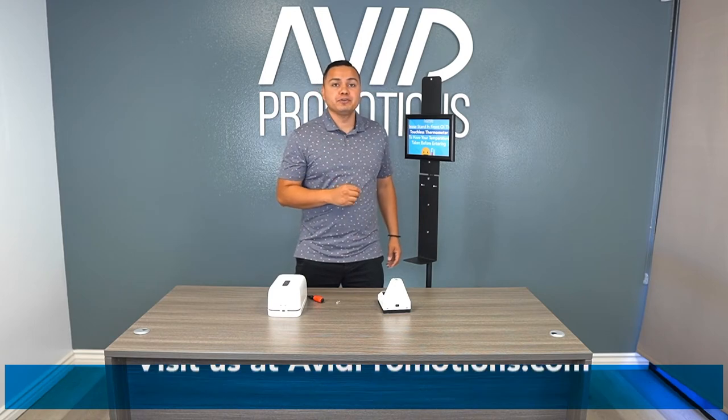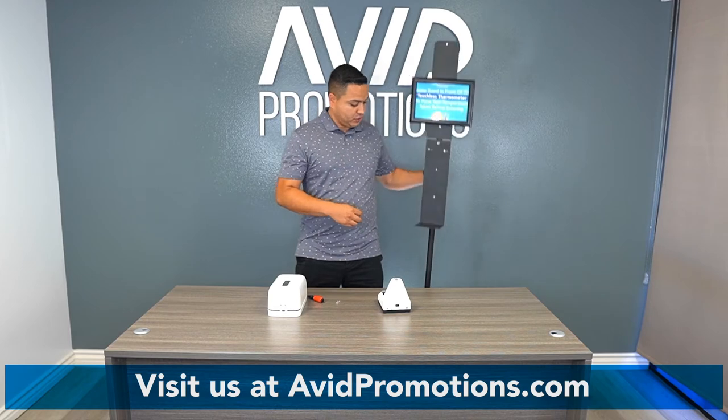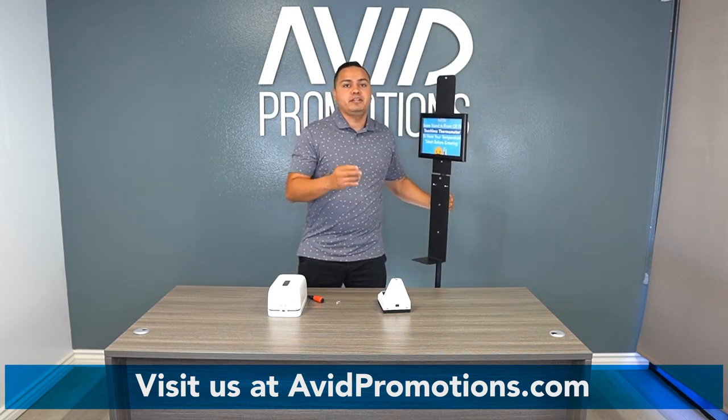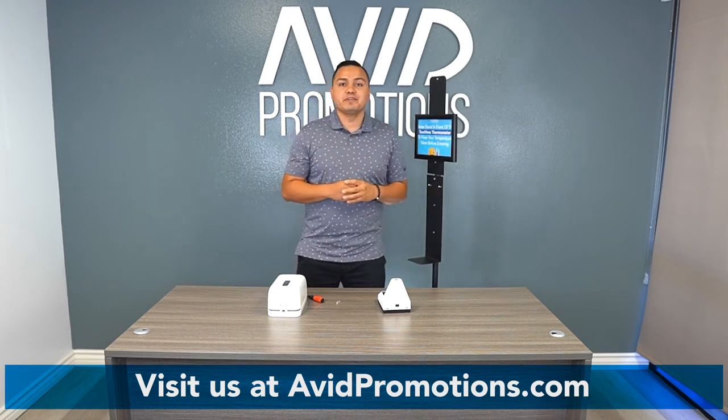The stand itself — the first thing to do is figure out if it's for children or adults. If it's for children, you can remove this pull right here. It drops the stand by about 18 to 24 inches. If you're going with adults, just keep it like this.